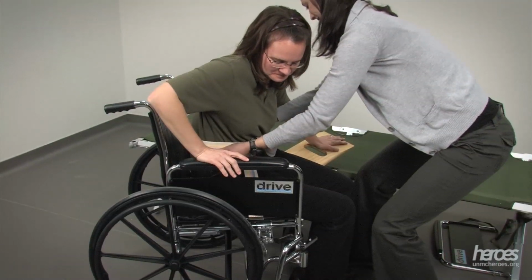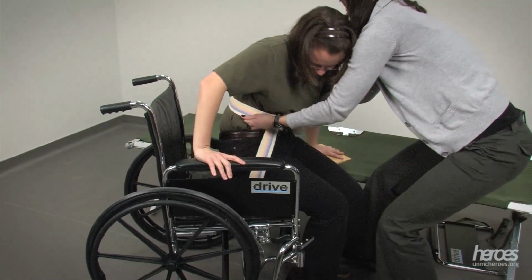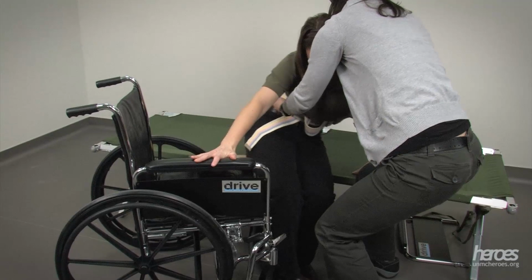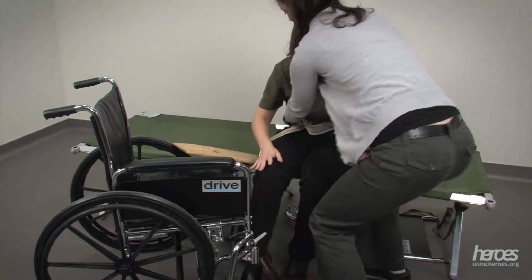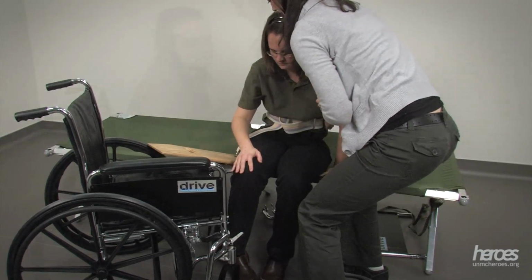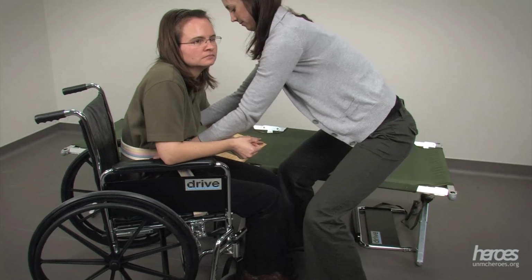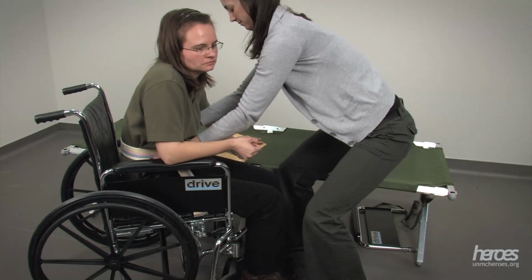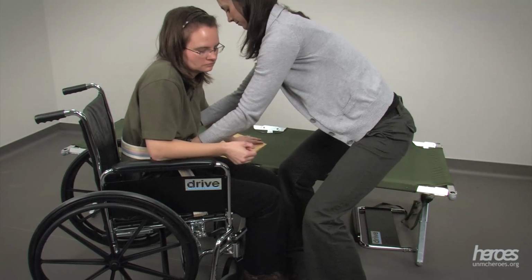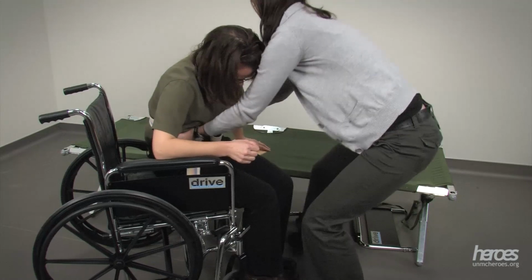Ask the individual to do small push-up type movements using both their arms, with one arm pushing from the armrest and the other arm pushing from the slide board. Move across the slide board by having the individual perform 2 to 3 of these push-ups. If the individual is not able to do small push-ups, they can move their buttocks across the slide board by scooting sideways using a series of small movements. For either technique, help the individual by guiding their trunk with your hands on the gait belt.